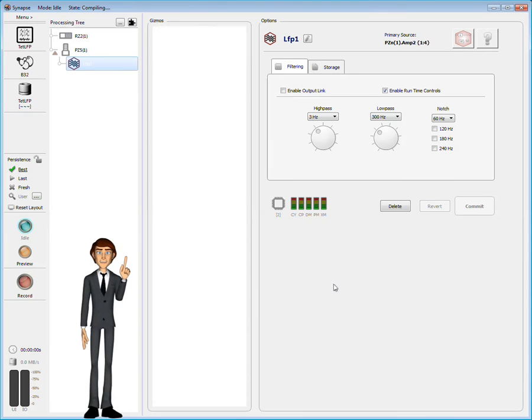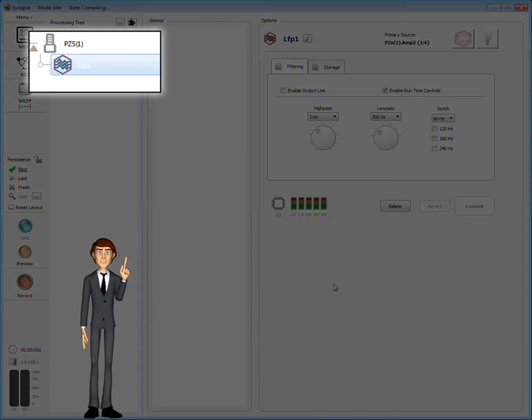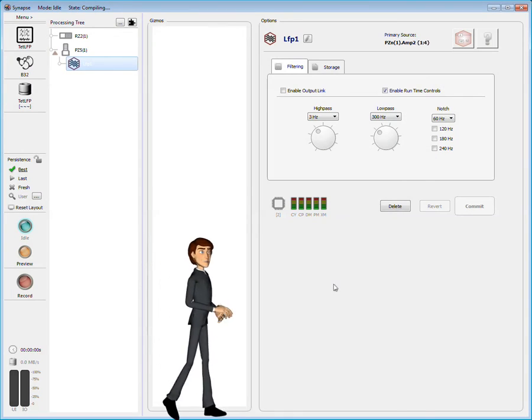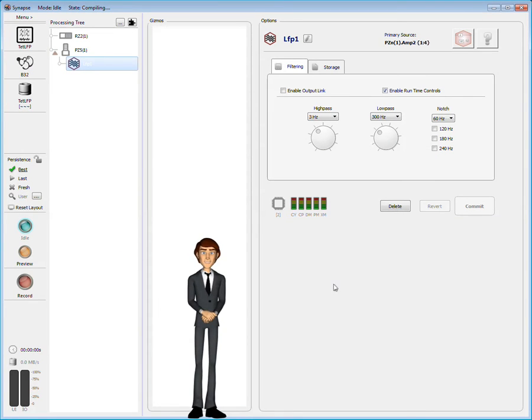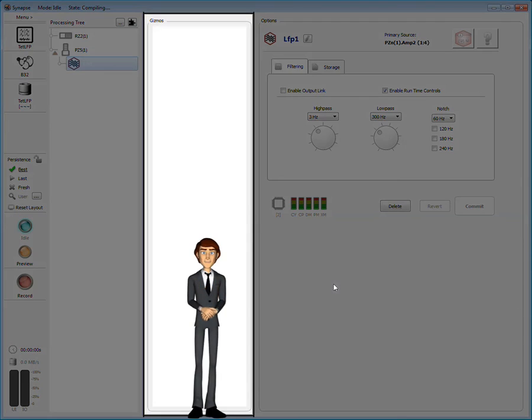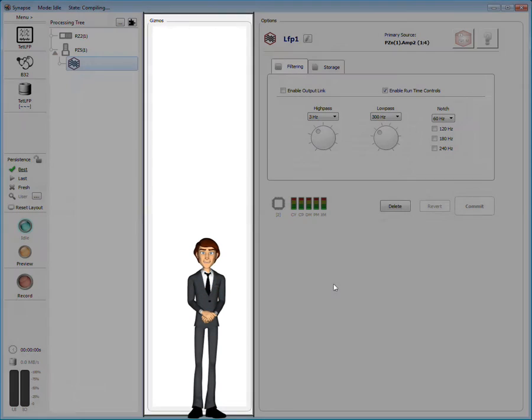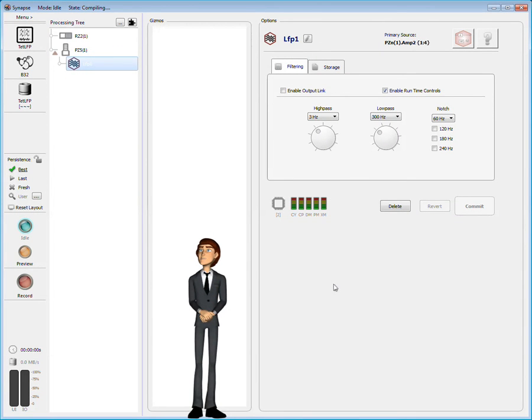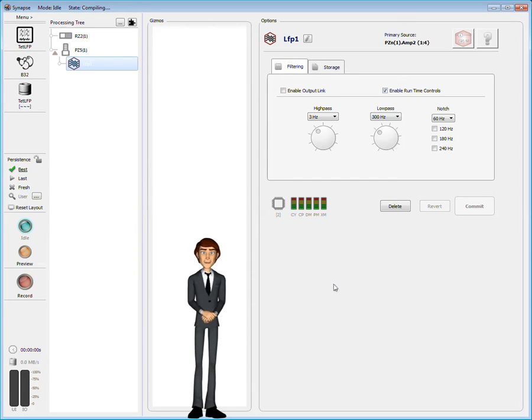The gizmo has been added to the processing tree beneath the PZ5 amplifier, and its settings are displayed to the right. We see no gizmos in the gizmo list because the LFP gizmo is now selected in the processing tree.